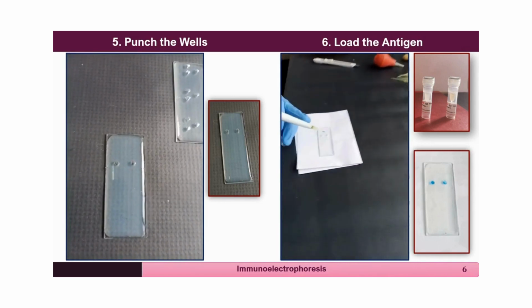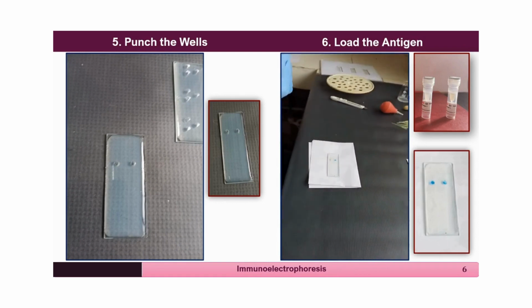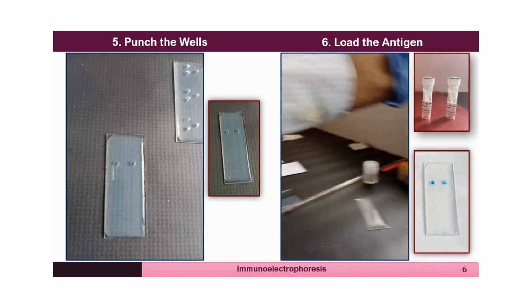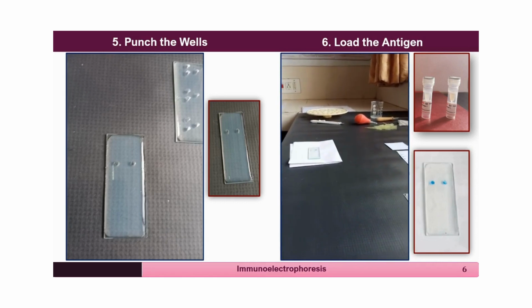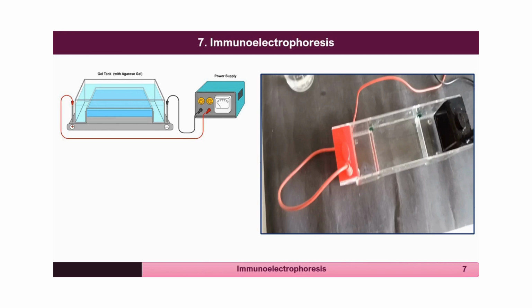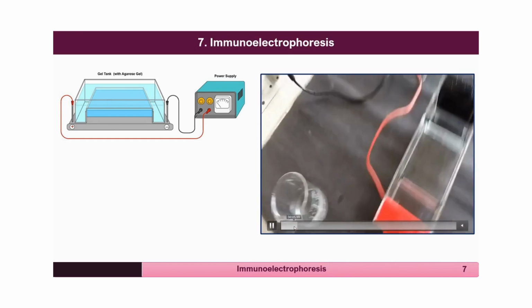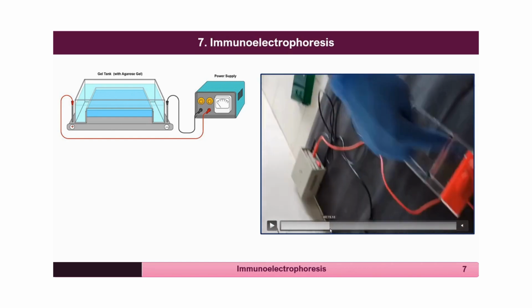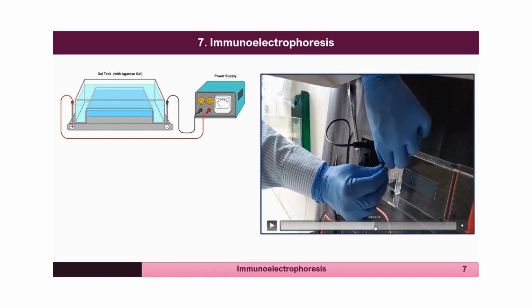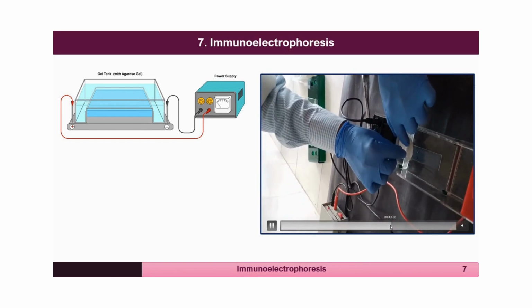and the antigen is generally mixed with the tracking dye, that is bromophenol blue, because when you carry out the electrophoresis, it is necessary to know the mobility of the sample, and you should allow the sample to move towards the other side. The antigen side is connected to the negative pole. Once the sample is loaded, it is kept on the platform of the electrophoresis chamber such that the antigen loaded side is connected to the negative pole, and a gauze piece dipped in buffer is slowly laid on the side of the slide so that it supplies the current.